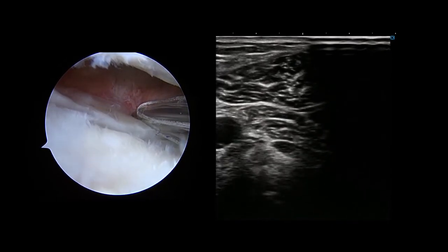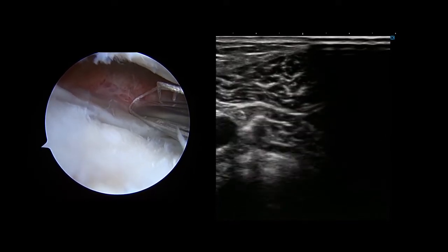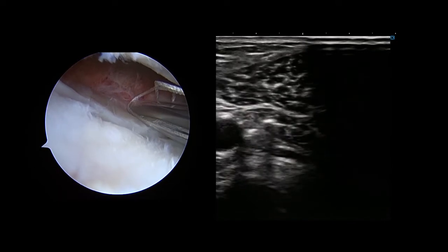An all-inside suture device, the jugger stitch, is introduced from an anterolateral portal, and the tip of the needle is observed in the ultrasound image.